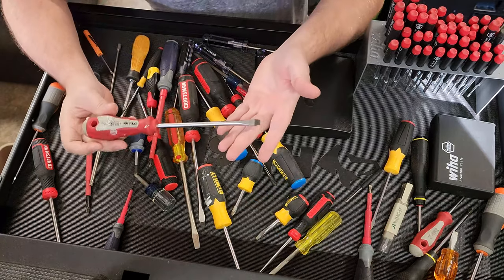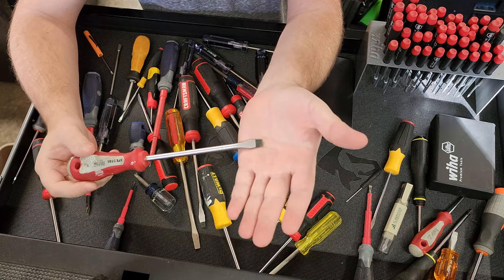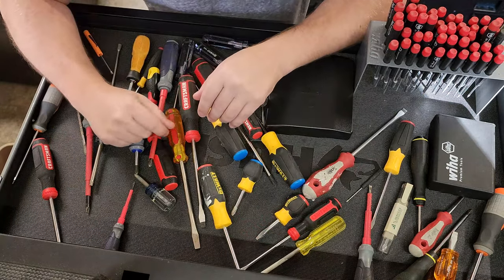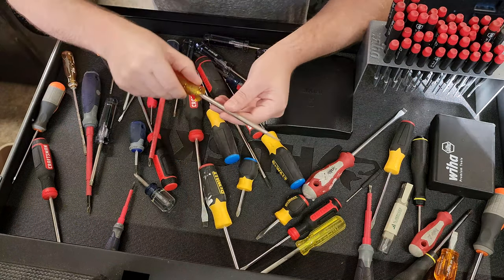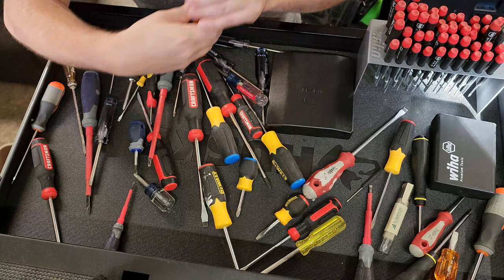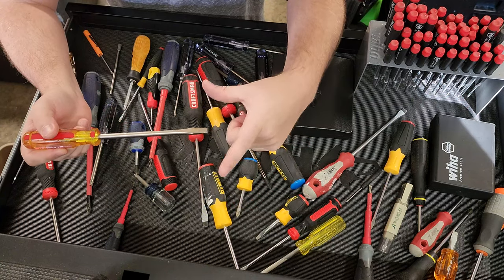We have to start out with a flat blade screwdriver. Flat blades are one of the oldest type of screws and they're still pretty common in many types of devices today. There are different sizes for screwdrivers — those sizes are usually attributed to a number like number two, number three, number one, number zero. For flat blades, I believe they measure them in millimeters nowadays, so it'd be 2.5 millimeter, 3 millimeter — that would be your blade width.